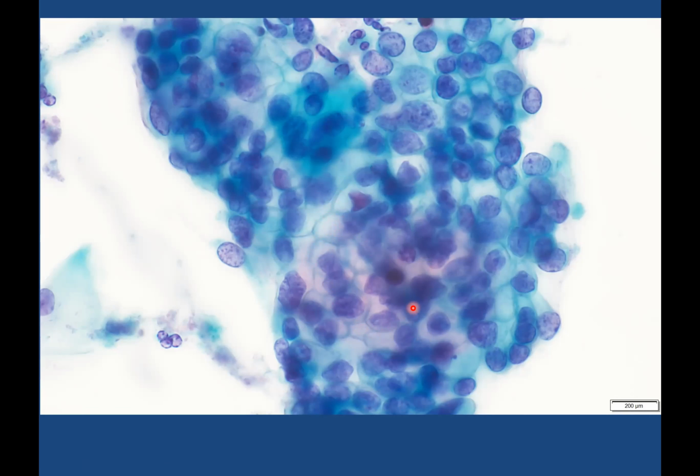When we look at these nuclei, first of all, I want you to see the arrangement. Are they a regular honeycomb arrangement? I'd say no. I think we've got vague gland openings and orientation here and here and here. Now let's have a look at the chromatin. If we take this one, for the sake of argument, as being kind of all right, although I would say the chromatin is still a little coarse, when you look at this one here in the same field of focus, you can see that it is slightly darker staining.